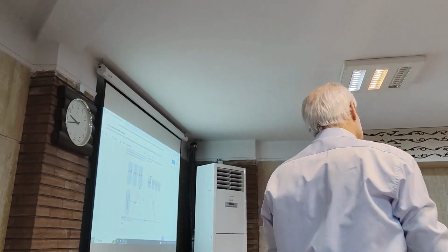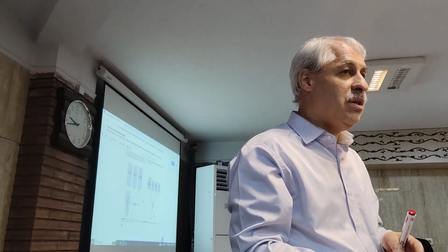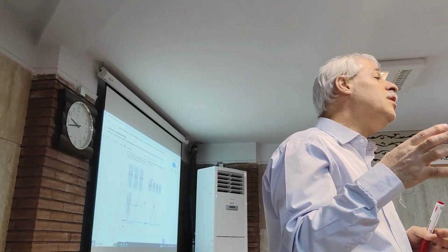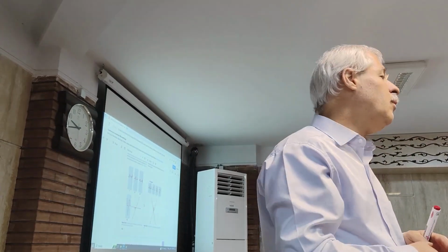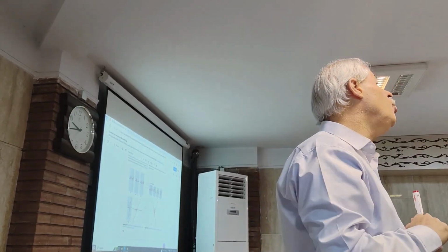And if these ST changes persist and you do not make any intervention, these ST changes will be changed into myocardial death, means the cells will have died. And instead of that ST change, you will have a Q wave.